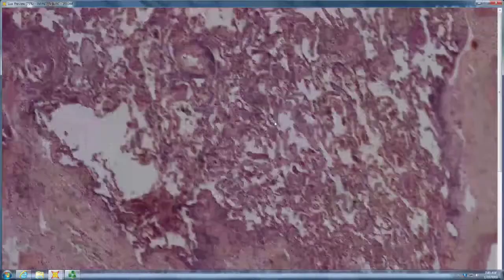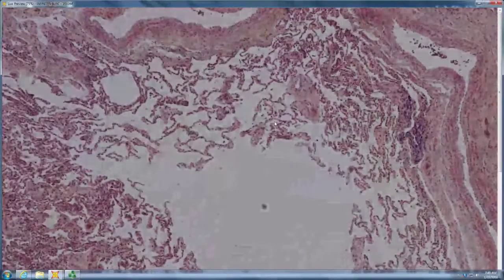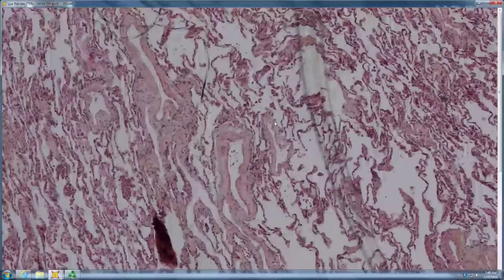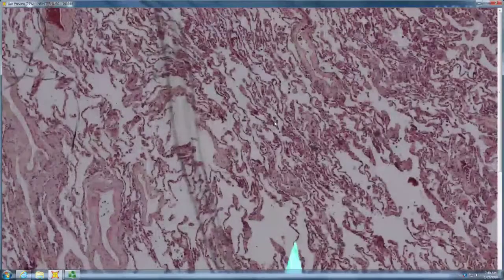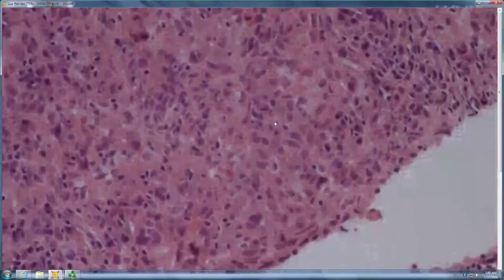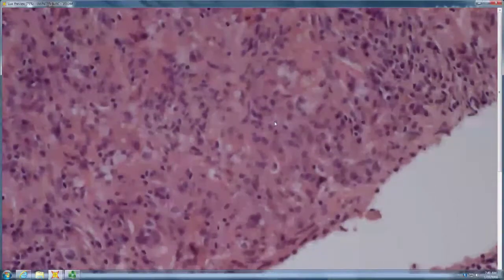Okay, so David, where do you think you are first off? Kind of deep dermis, subcu. There's a lot of vessels. Lung, alveoli. Okay, so we're not in skin, but the organisms look the same regardless of where you are. So, some kind of lung nodule, consolidation.